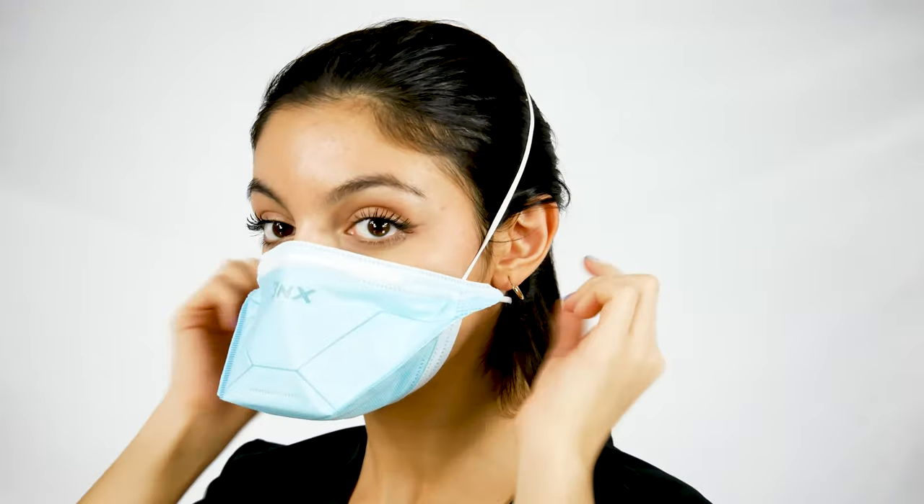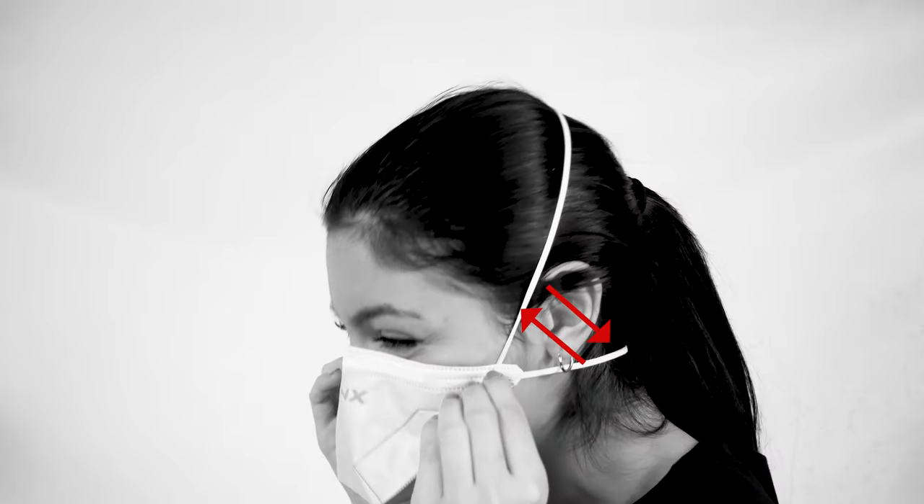Straighten the bands. If the mask is feeling too tight, you're probably switching the bands. To alleviate this, simply swap the bands.